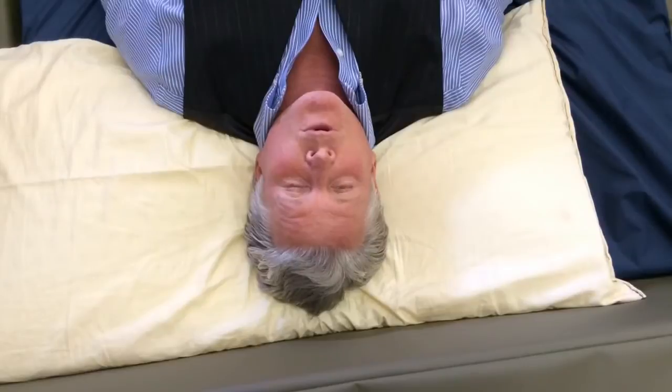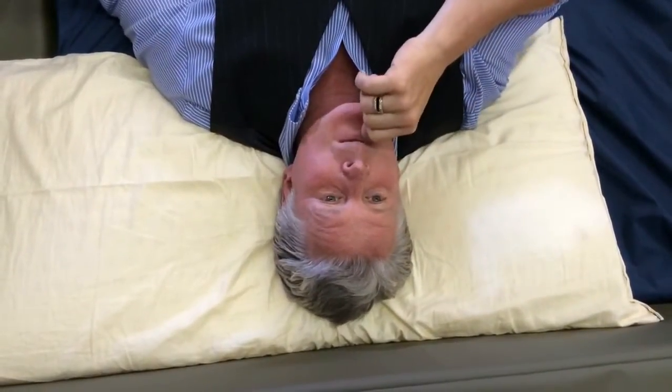We tried at first to produce something that would have a low bed underneath the mattress so that it could be elevated for cares, but we really failed miserably to arrive at something that was going to be stable and strong enough to handle the thrashing of a person going through the Huntington's disease process. And we did settle back down to just being on the floor.